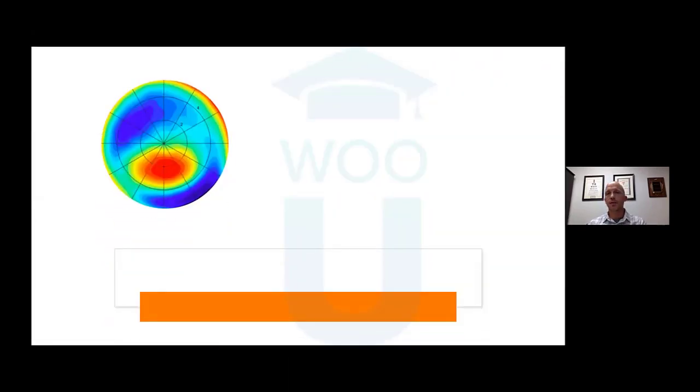And so to start, we have him out of his hybrid lens for a week or longer. And then he comes in and we measure his eye using corneal scleral topography. This is the corneal elevation map, and you can see that he obviously has keratoconus with an oval apex, inferiorly located.